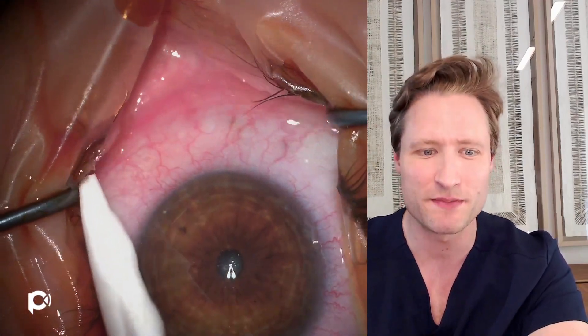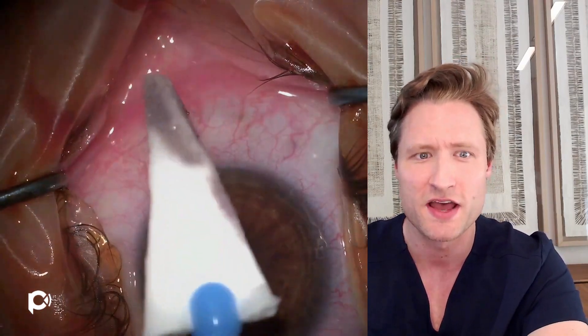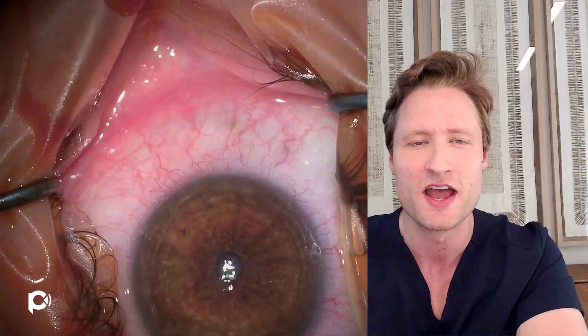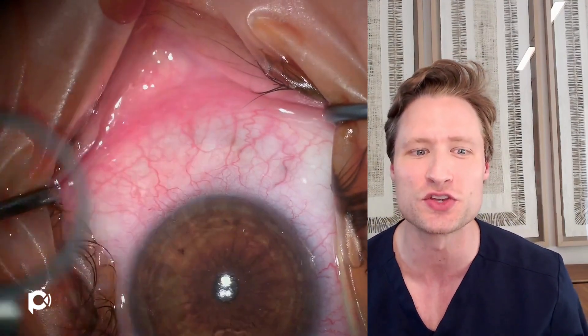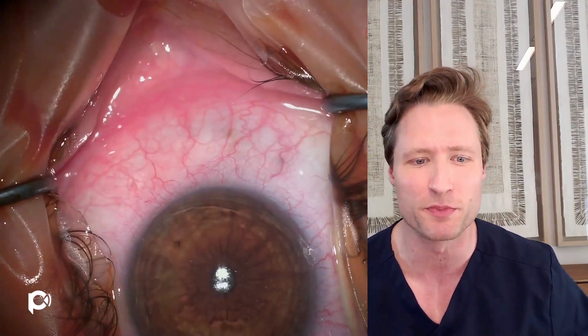The first thing I'll do is use these Maricel WEX sponges to gently blot the epithelial surface so that the zone marker can leave an imprint. These are not cellulose — they are not compressed bits of a normal WEX cell. The reason is that a typical surgical sponge, a WEX cell, is friable and flaky and can break off and be insinuated into the stromal tunnels we'll use. So a Maricel sponge is a little bit better.